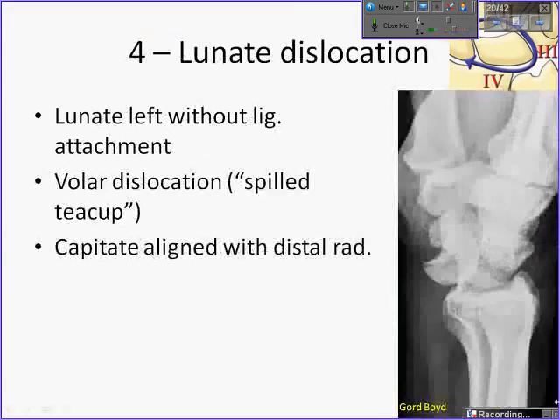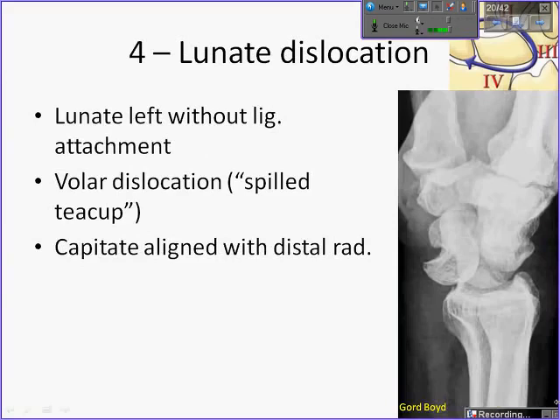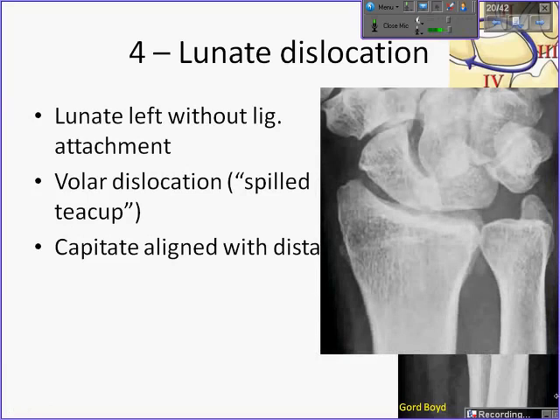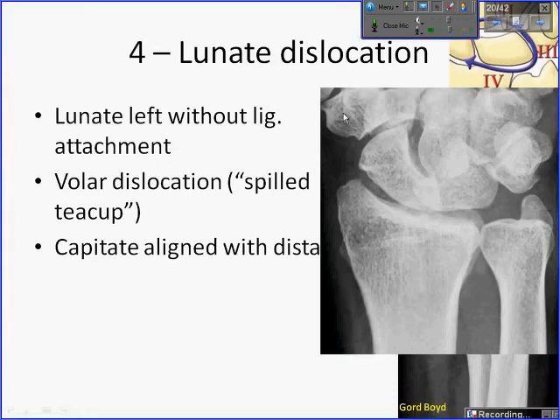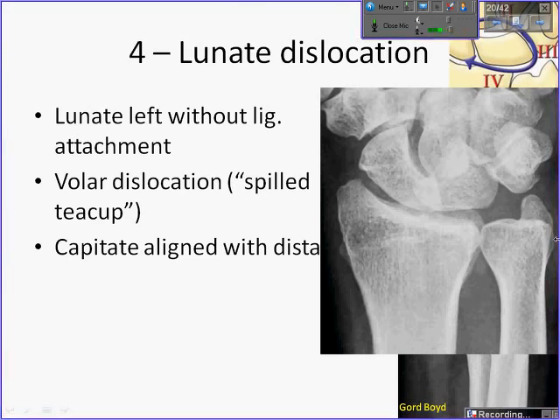The fourth stage is when the lunate is left without any ligamentous attachments whatsoever. The lunate dislocates in a volar direction, resulting in the classic spilt teacup sign. The capitate is aligned with the distal radius — this is a typical perilunate dislocation. On the PA radiograph, when the lunate is inclined volarly it will have a triangular rather than trapezoidal appearance. The second carpal arc is disrupted, and there is overlap between the lunate, scaphoid, and capitate — indicating significant injury before you even look at the lateral.